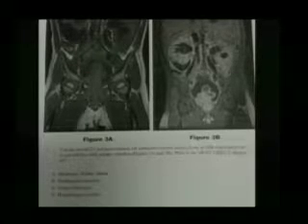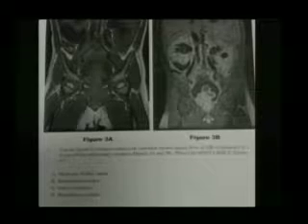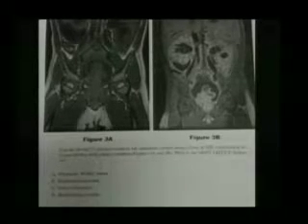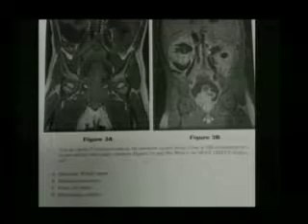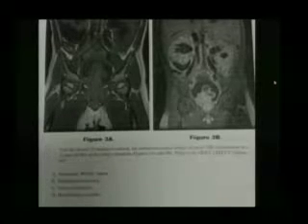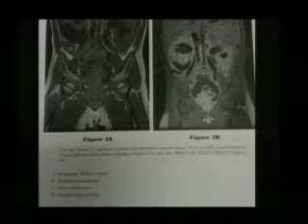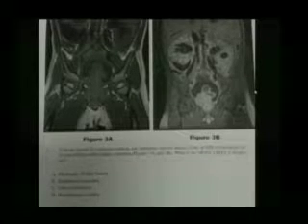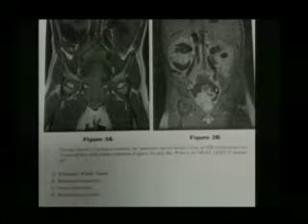Okay, Nor. You were shown a T1 post-contrast fat-sat coronal image of the MR exam in a 3-year-old boy with urinary retention. What is the most likely diagnosis? Yes. Okay. You don't see an enhancing mass? What is this structure? This is pre-contrast, this is post-contrast. Is there anything that turned white? Very good. The most common, this is what organ?